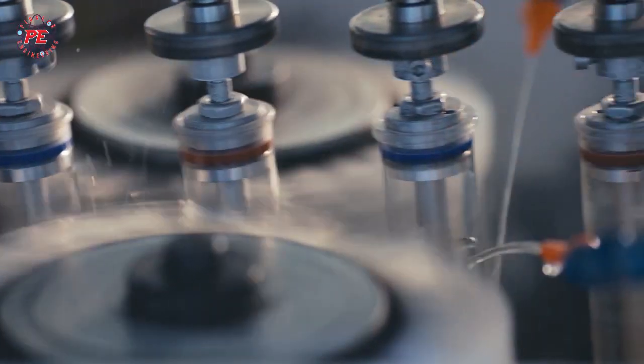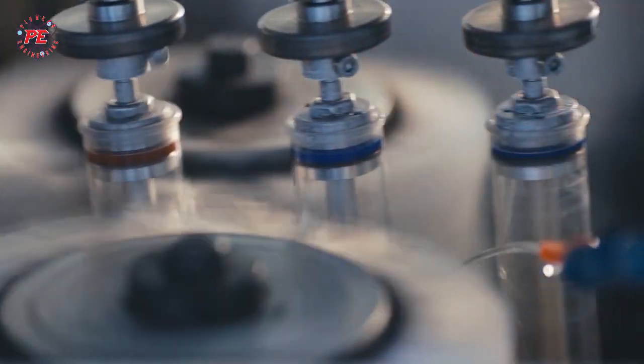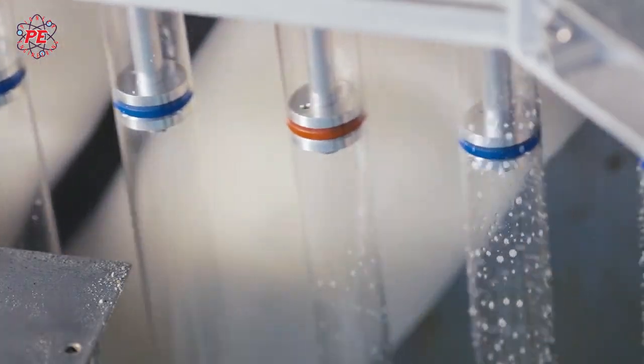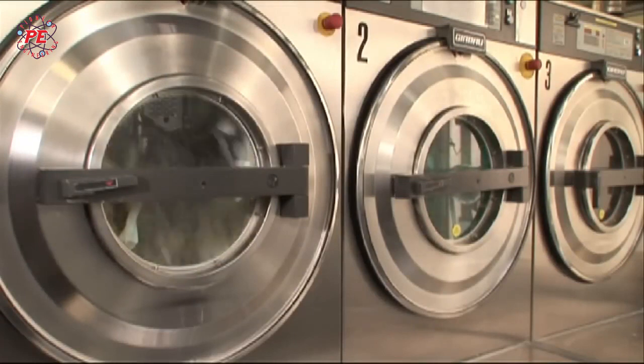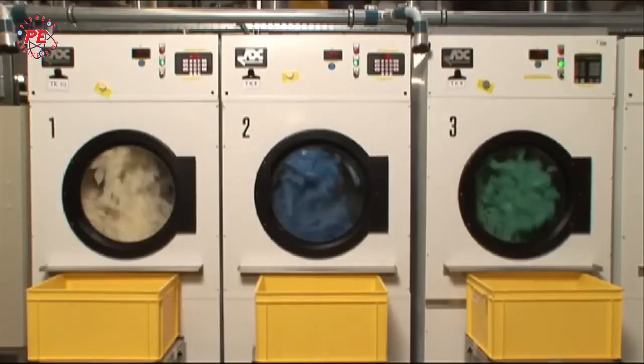Next, the condom will be removed from the mold with a cold water spray. There are 80,000 condoms per hour that are removed from the mold by air jet. These condoms then fall onto the conveyor and into the washing machine for 60 minutes to make sure the condoms are completely sterile.